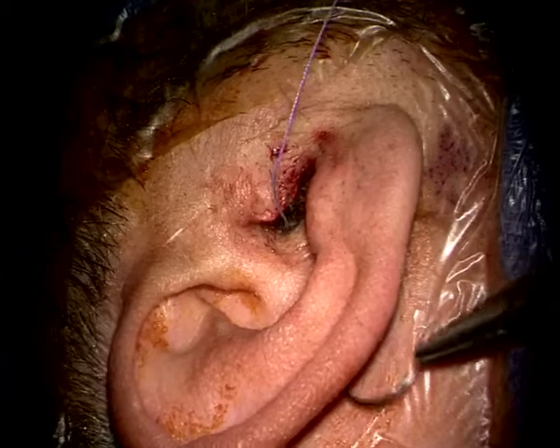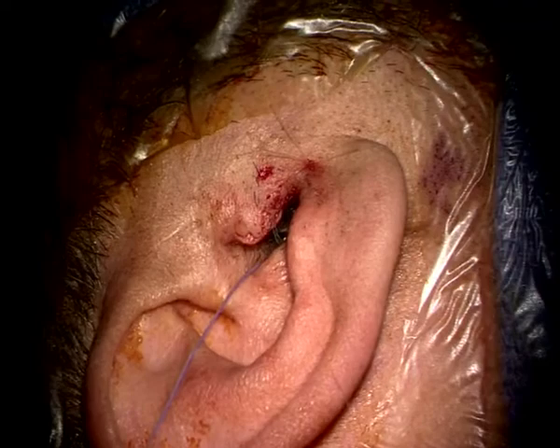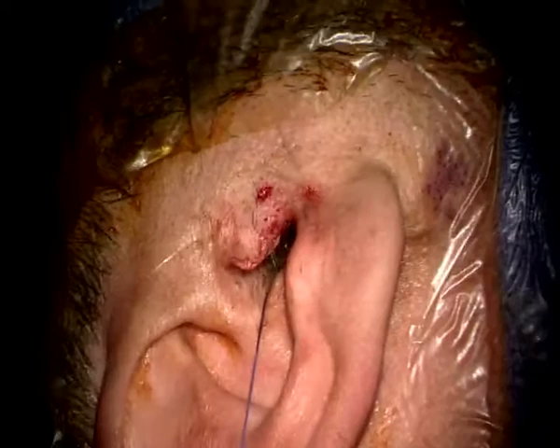You could see the idea basically. Cut. Take. Give me the. So the idea is to pull back. Tuck it with a mosquito or a needle holder. I find it. This is needle holder? Yes. Okay.